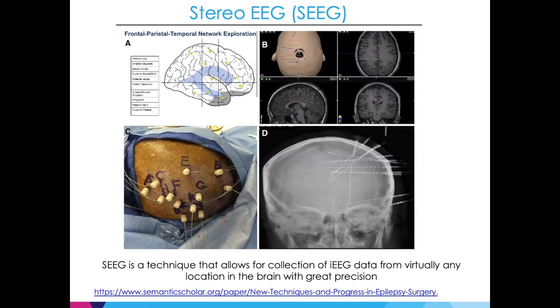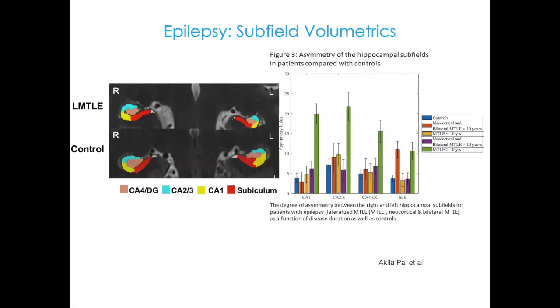Some of the advantages of 7T data are to explore more minimally invasive options, such as the implantation of minimally invasive stereo EEG leads. These allow us to validate that these areas are involved in the seizure network, and maybe place more dense leads in areas that we think are more highly suspected.